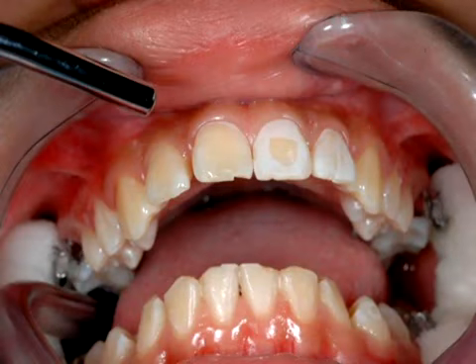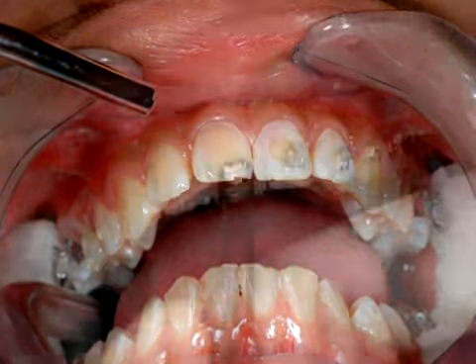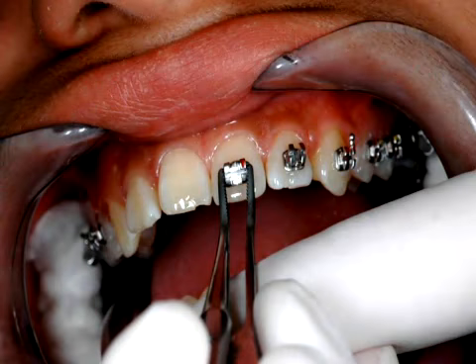At this time, check to see that the enamel is shiny. If the enamel is shiny, then you can proceed with the application of the bracket with paste. If the enamel is not shiny, still dull and chalky, then apply a second or third coat and dry after the last coat only. The bracket at this stage can be placed with any light cure, chemical cure, or dual cure adhesive paste, regardless of manufacturer.